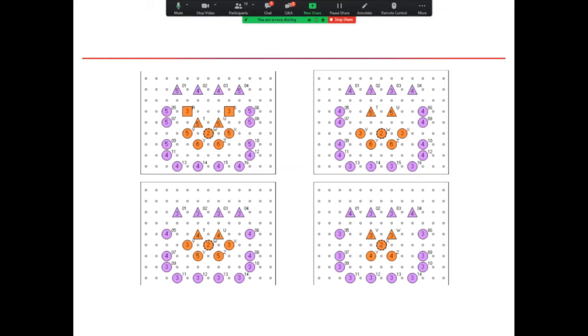One of the requirements set for us is that we have to work at 1 millimeter accuracy. This has been achieved by discretizing the geometric search space and choosing needle paths that maximize the number of seeds reachable for each needle trajectory. The results of our algorithm and tests showed that within a single insertion and a maximum of 5 different cannula trajectories, the seeds can be placed in their planned positions for the different cases we have tested. Just to give you an idea about the speed, it takes between 6 to 9 seconds to make the whole plan for the trajectory.